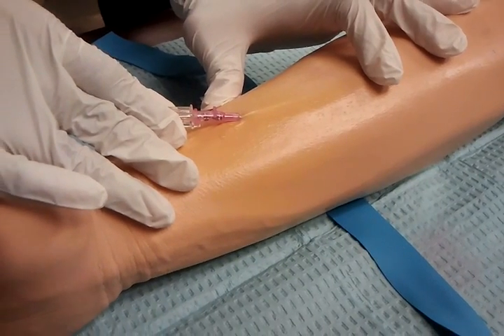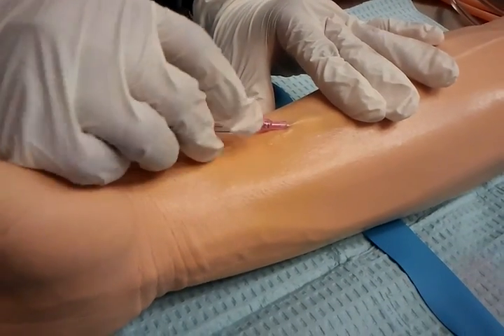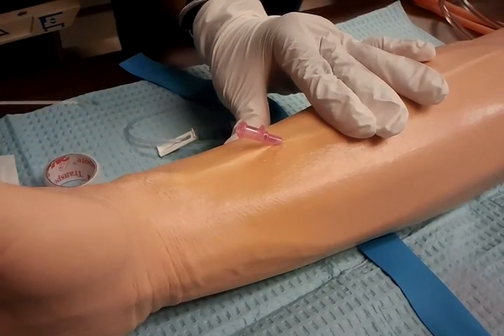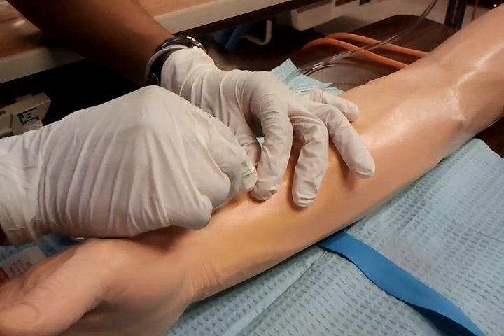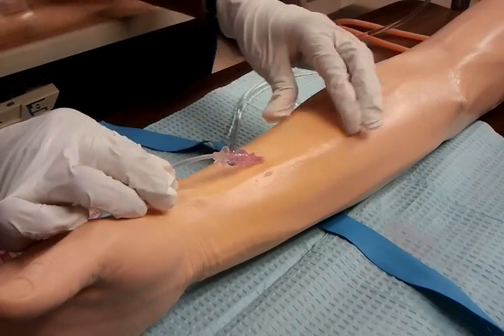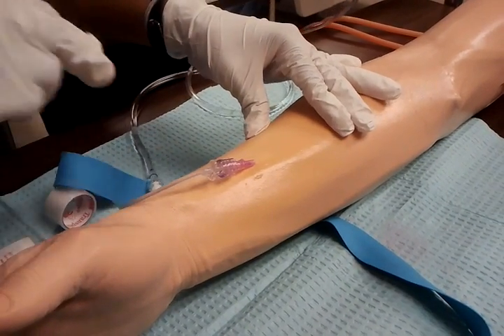Catheter is fully advanced. Apply pressure 1 to 1 1/4 inch above insertion site and remove stylet. Connect IV tubing primed with fluid. Secure the IV catheter and dress the site appropriately.